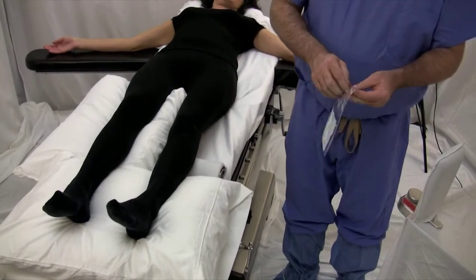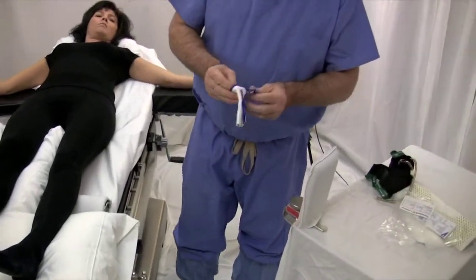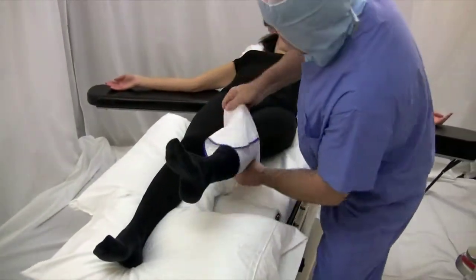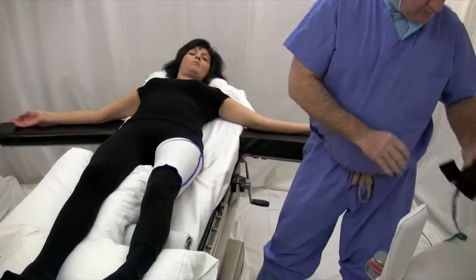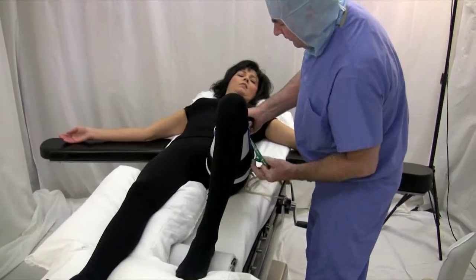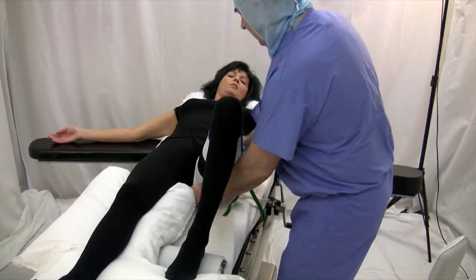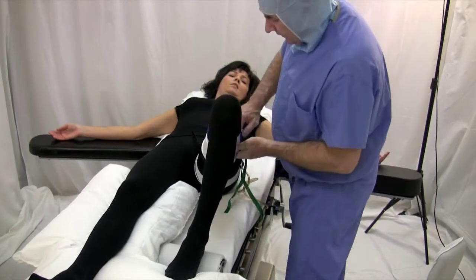Then I use a device called a tourniquet wrap, which facilitates putting on the tourniquet and also keeps the skin from being injured. The tourniquet wrap allows the tourniquet to be placed very proximally on the thigh.